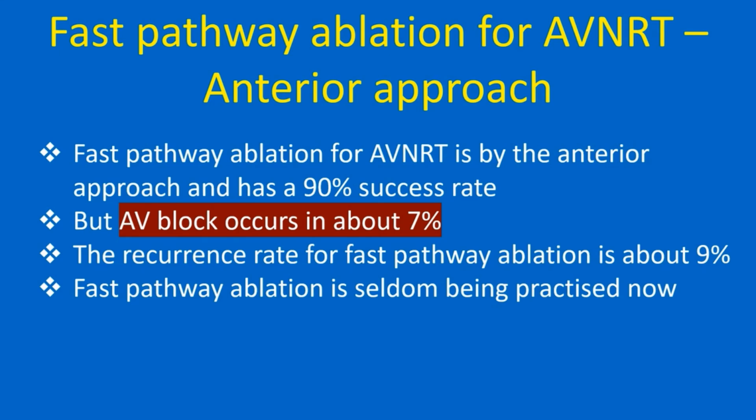But AV block occurs in about 7%. The recurrence rate for fast pathway ablation is about 9%. Fast pathway ablation is seldom being practiced now.